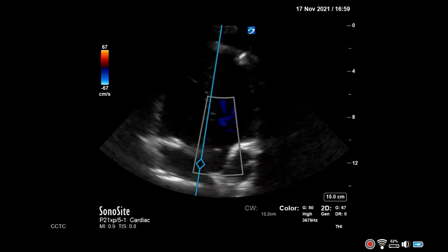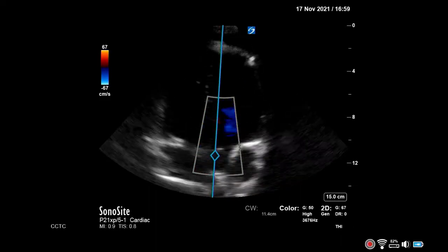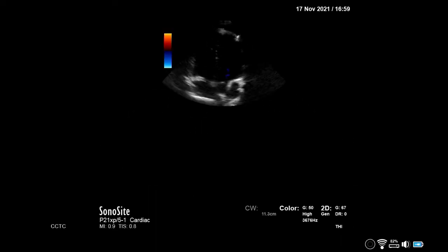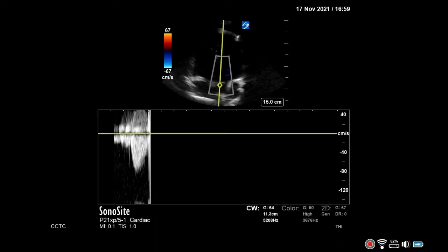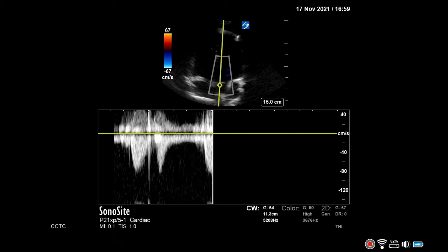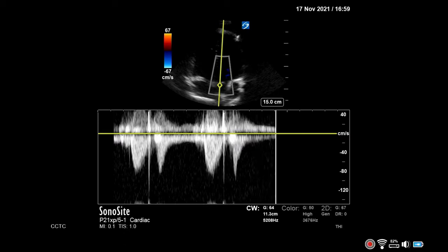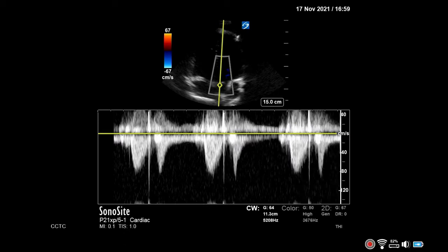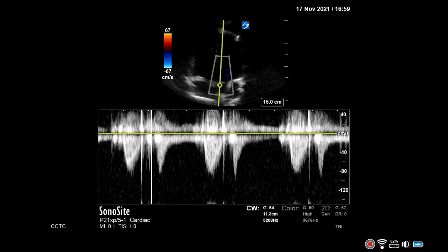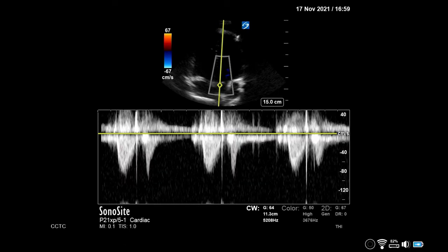Enable continuous wave Doppler and align it with the flow crossing the aortic valve. Once an adequate waveform is obtained, freeze the image. Trace the envelope to obtain the aortic valve VTI.